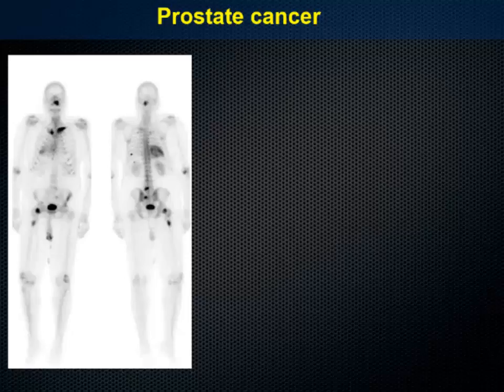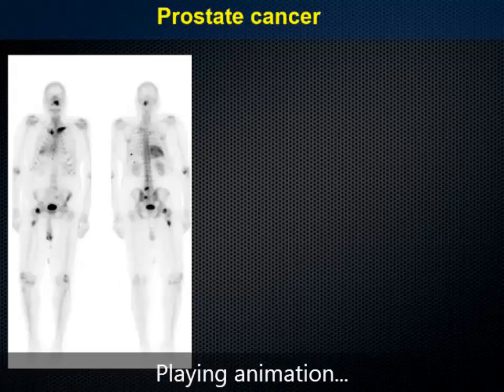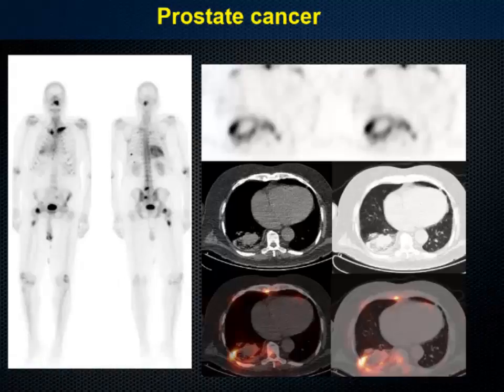I was thrilled because often we see this in patients with breast cancer with liver mets, or with any other cancer like colorectal with the bone scan. We see liver mets often take up, but this was not liver, it was in the lung. There's a lung lesion, there's a consolidation, but the uptake is not around the consolidation, it's around the periphery of the consolidation. So we said it could be primary, so we are awaiting the diagnosis. These are the things we can pick up when you do complementary investigations. Otherwise, I would have said bone metastasis, but do further investigation to clarify whatever the pathology is in the chest.